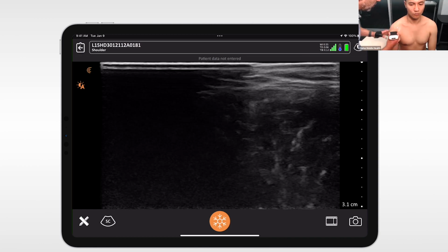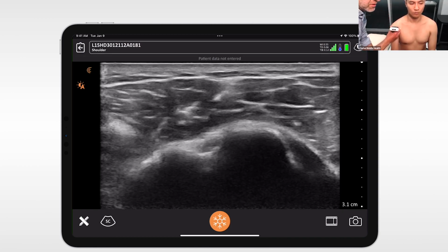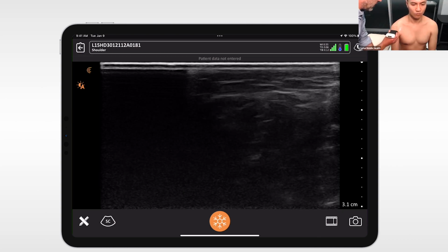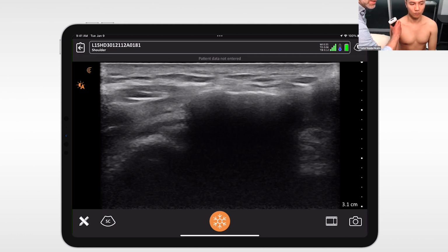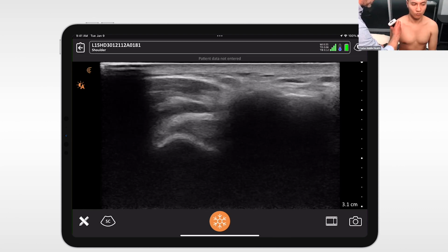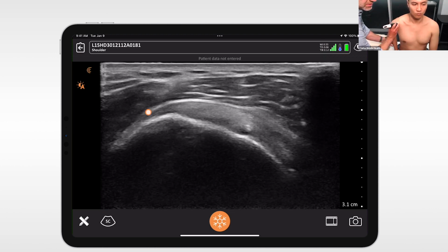Okay. And then, so you were doing some dynamic assessment of the shoulder. I've always done more of the dynamic assessment coming up. So we're coming oblique here, and there's the acromion and the humerus. Let's see if we can get, we'll take the arm back to identify supraspinatus here, right?